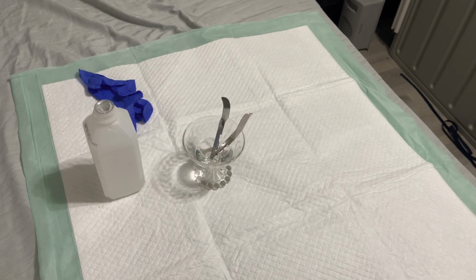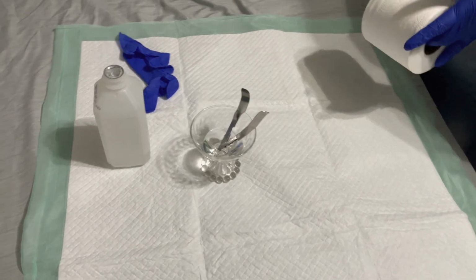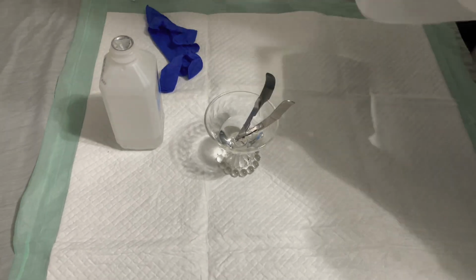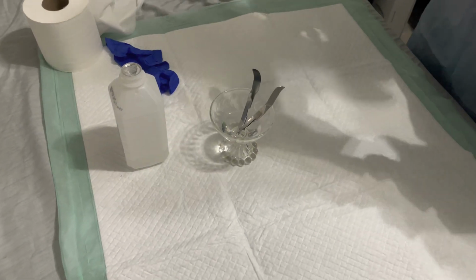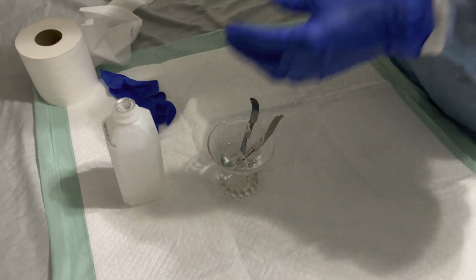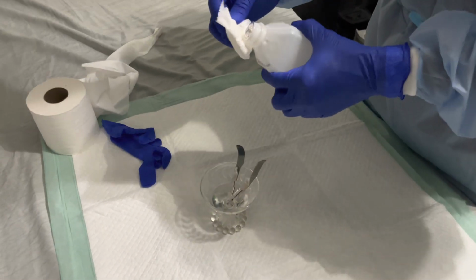Now the pup, a little bit of tissue, cotton swab, it doesn't really matter. We're gonna dab the tail a little bit because we are about to remove some stuff, and really we should just clean it up real good.